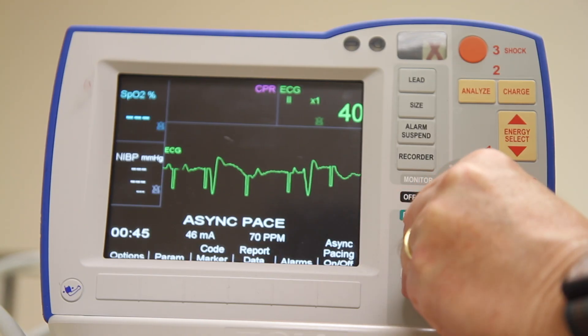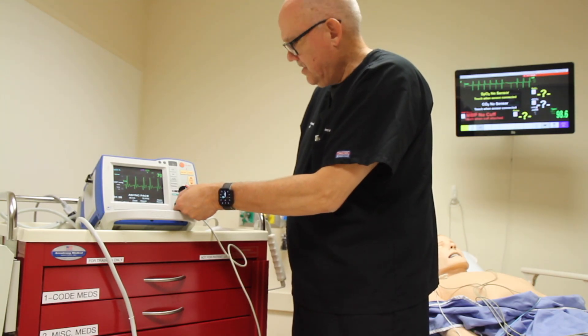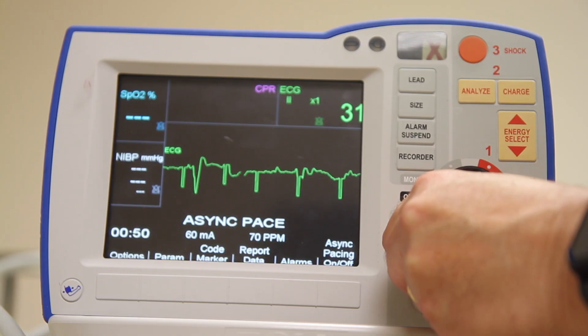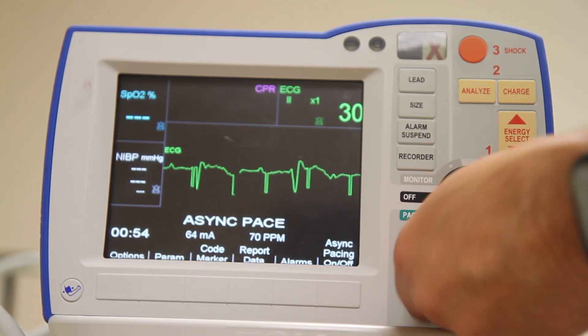You want to observe for capture. Capture is a downward pacing spike immediately followed by a QRS complex. We want to make sure that we see that consistently on the screen.